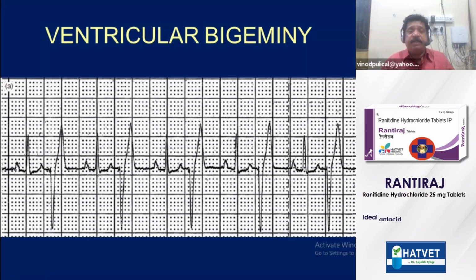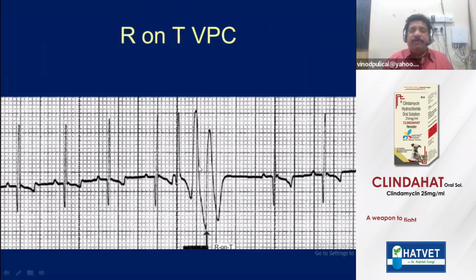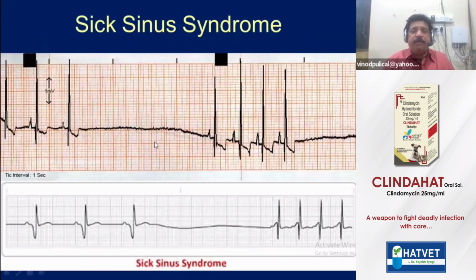It's very serious. This has to be investigated. This is R coming overlapping the T. R on T VPC. This is another VPC. Again, this is dangerous. This has to be investigated in kidney failures, etc.